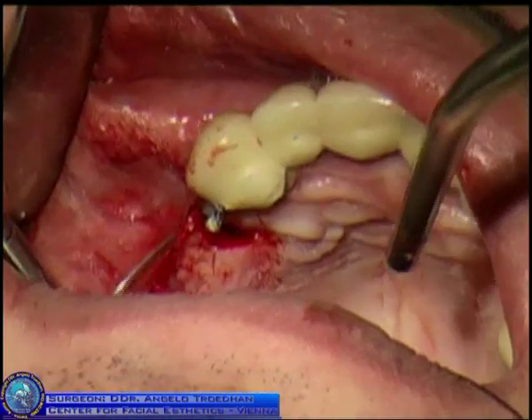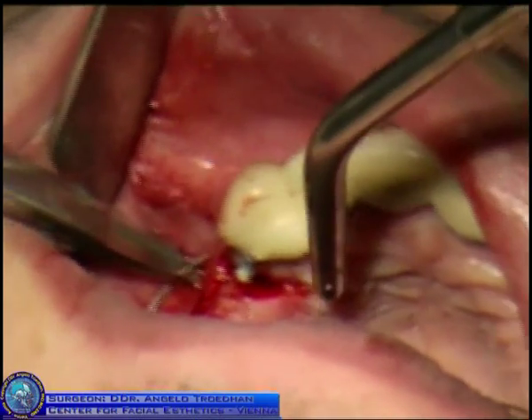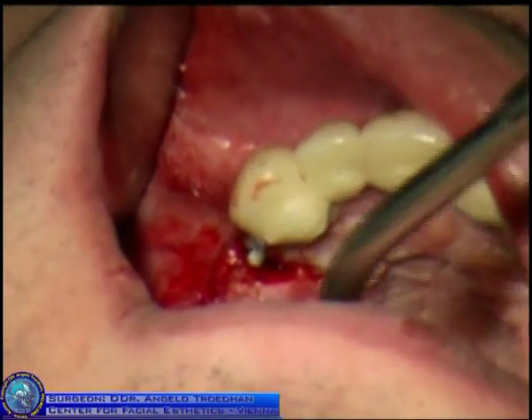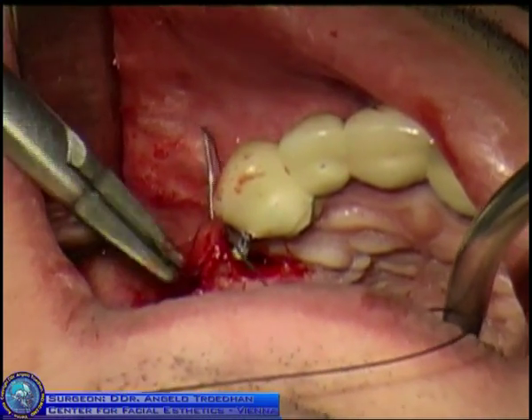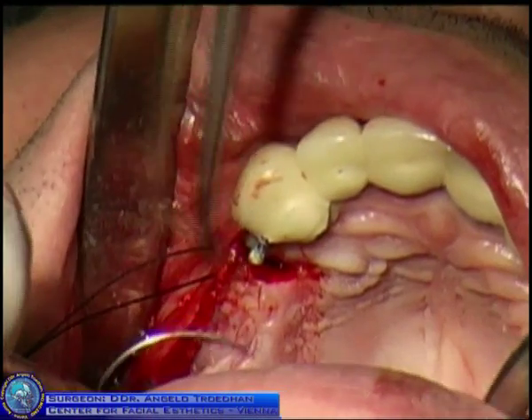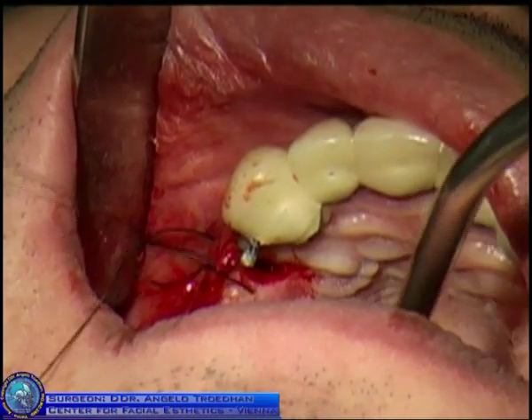The big needle gives me a little bit of a hard time, because normally it doesn't look so clumsy when I'm making sutures. But there is a half-true proverb saying: a good surgeon can work with everything. This is true, partly. But I couldn't do surgery without the piezotome anymore, because once you have driven a Rolls Royce, you won't drive a Volkswagen anymore.